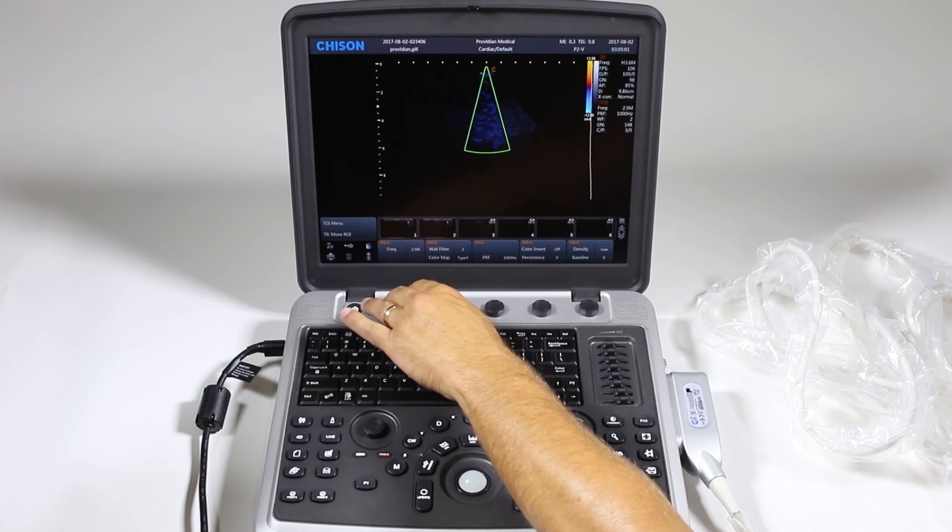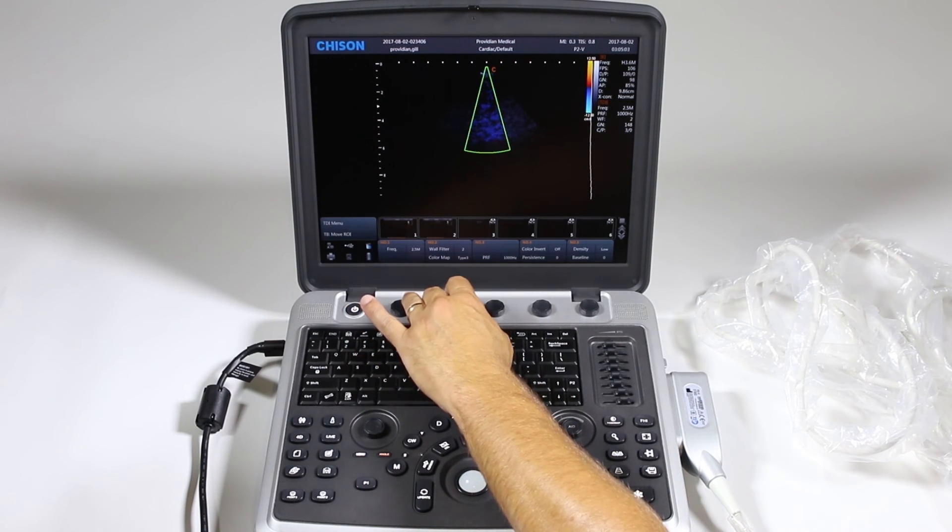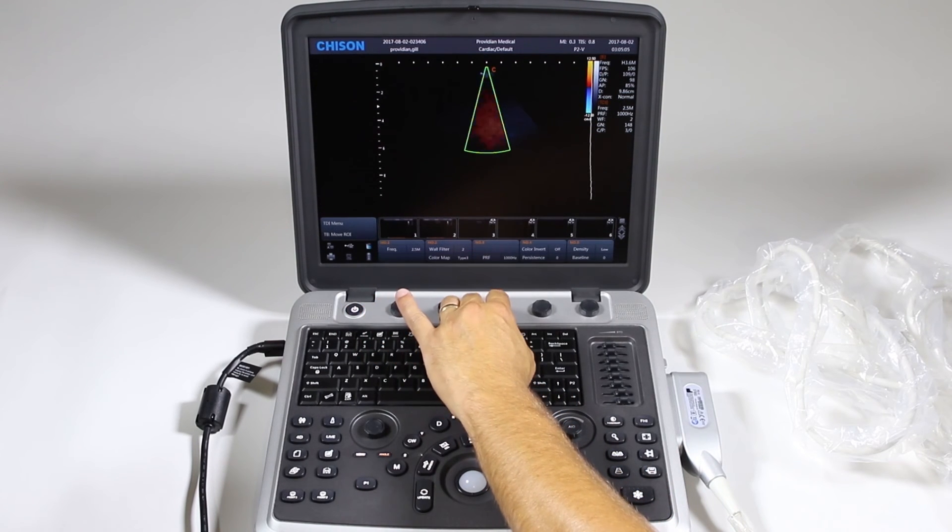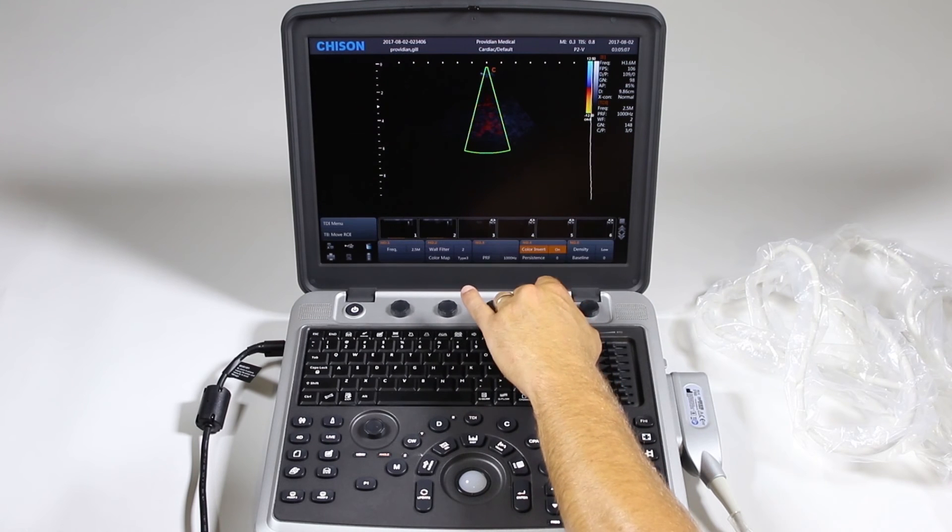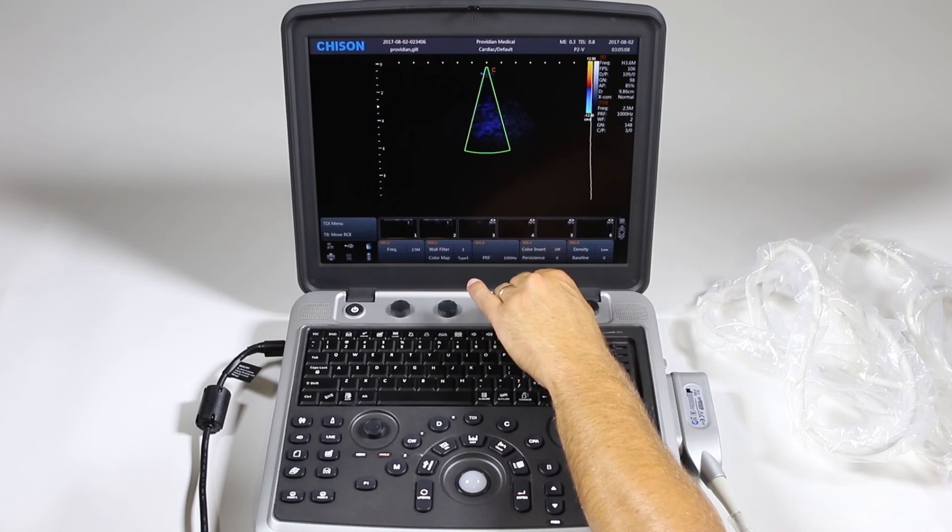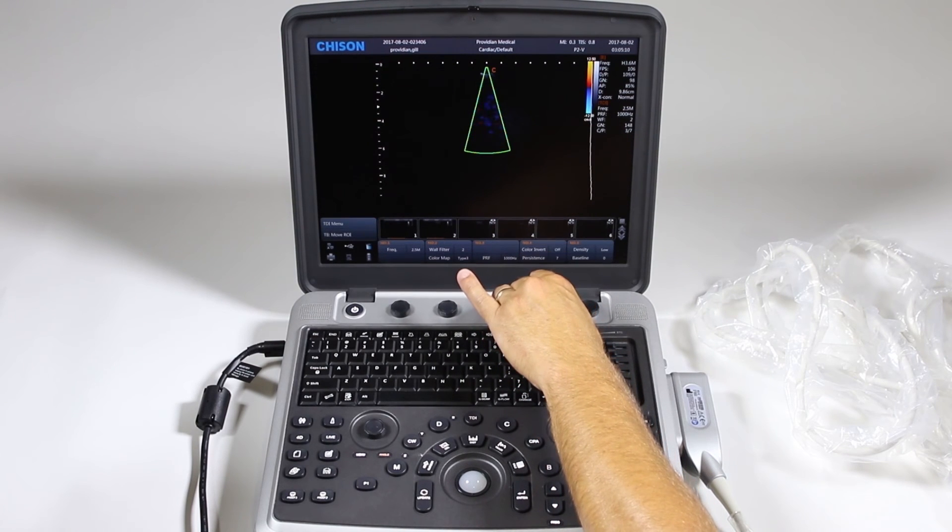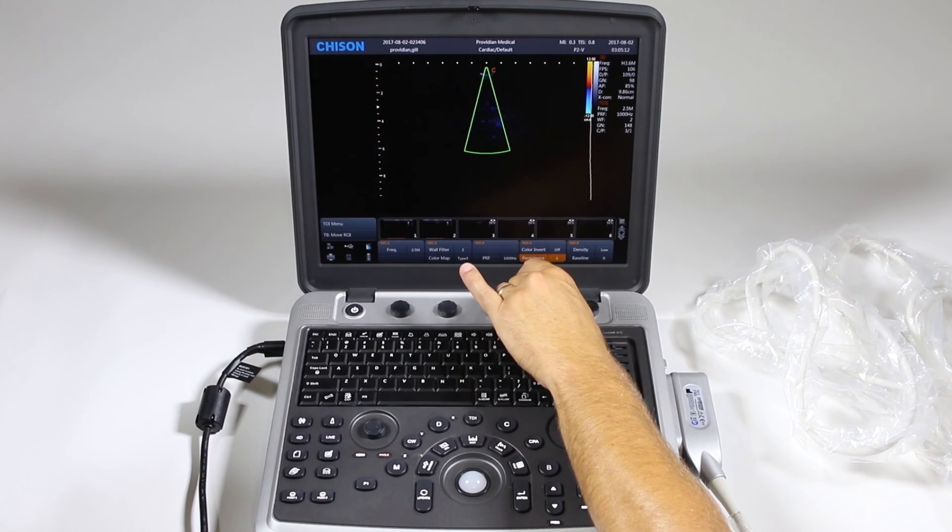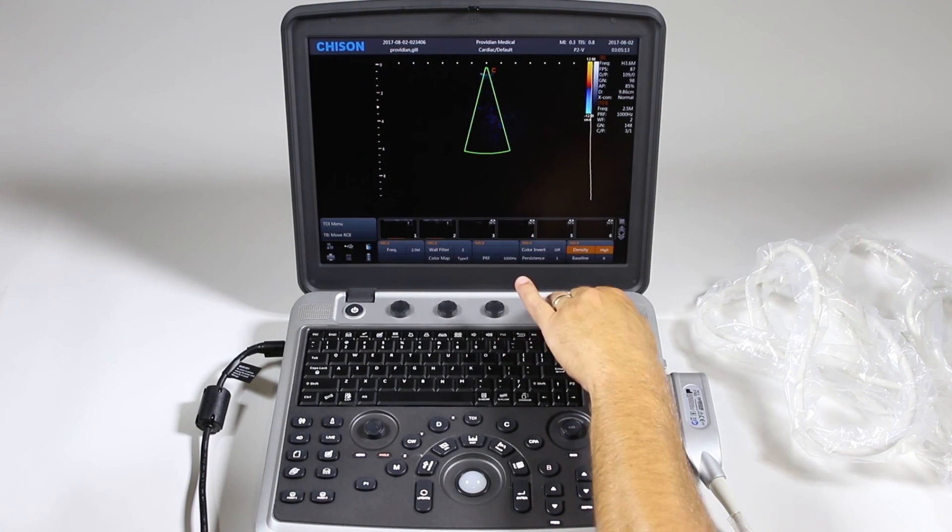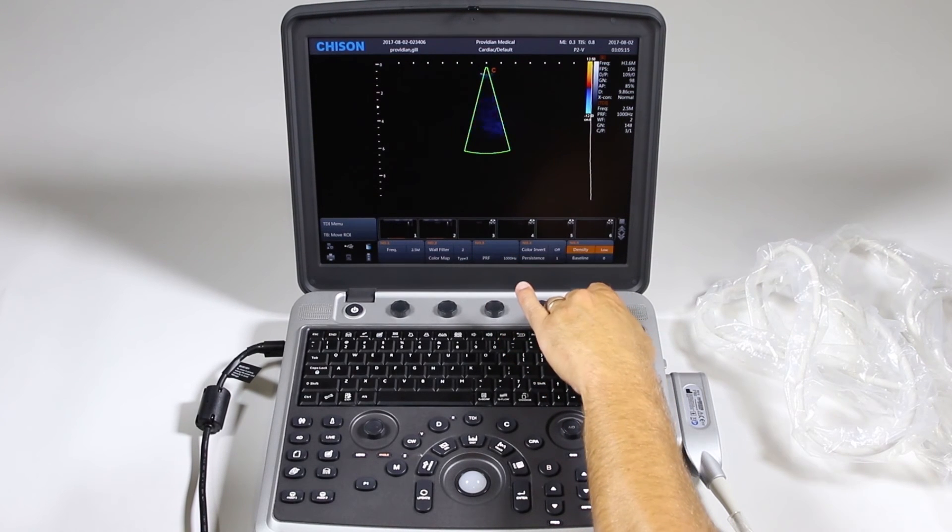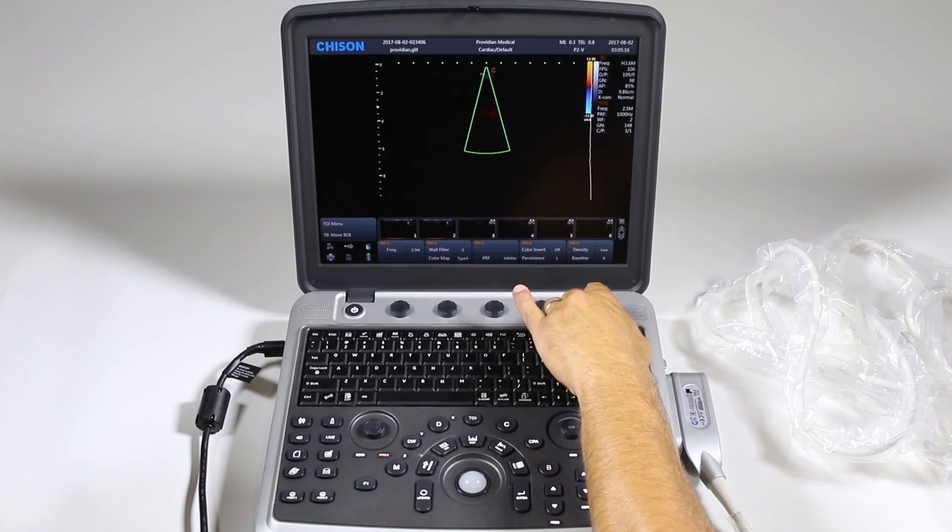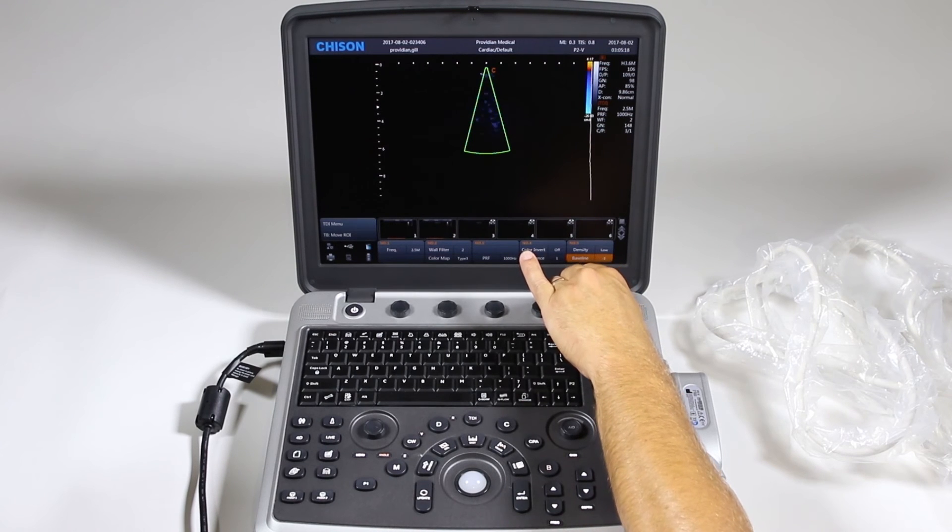Down here you can change your frequency, wall filter, color map, pulse repetition frequency, invert the color, change your persistence just like before. Line density, high or low and again that's going to change your frame rate. And change your baseline.